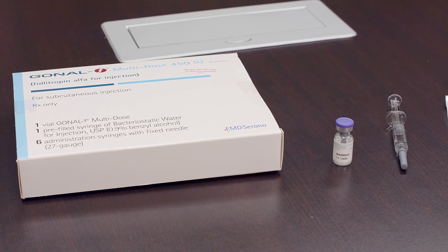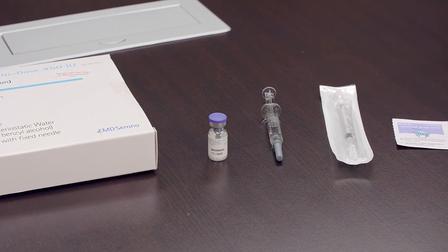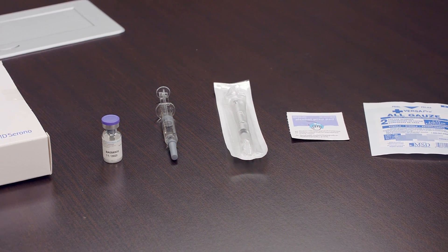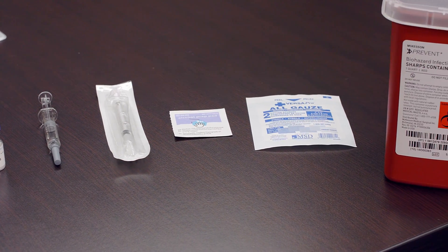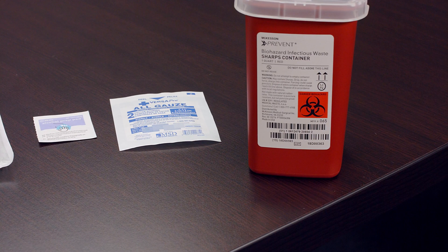You will need the following: a vial of Gonal-F powder, a pre-filled syringe labeled bacteriostatic water, a Gonal-F multi-dose custom dosing injection syringe provided with the medication, an alcohol prep wipe, gauze, and a sharps container.